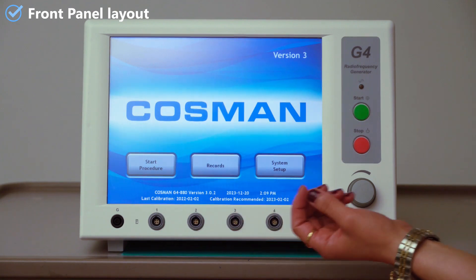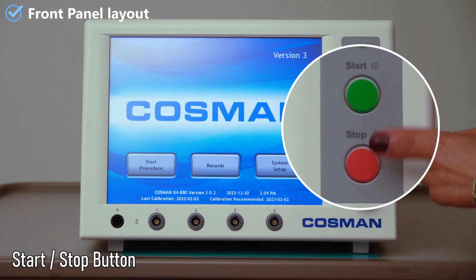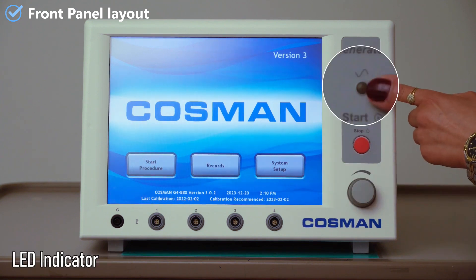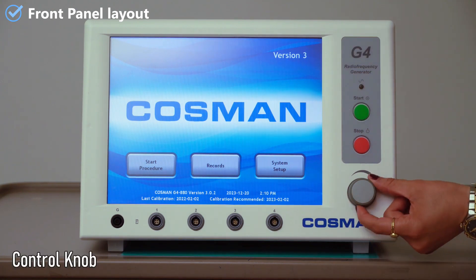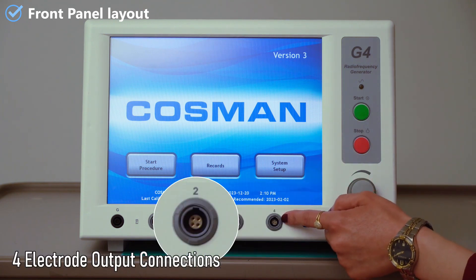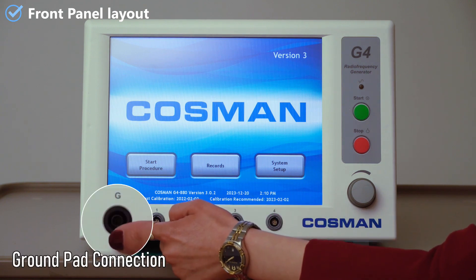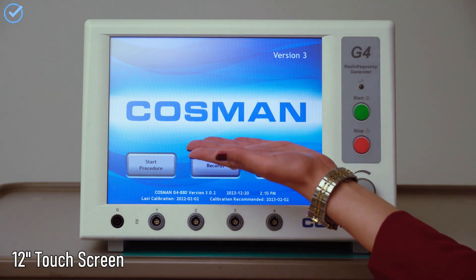Let's take a look at the front panel layout. Here are the start and stop buttons for turning on and off the electrode output. This is the illuminated output-on indicator when any electrode output is on. Here is the output control knob for manual output ramping. These are four electrode output connections. Over here is the ground pad connection for monopolar mode, and this is the 12-inch touchscreen.